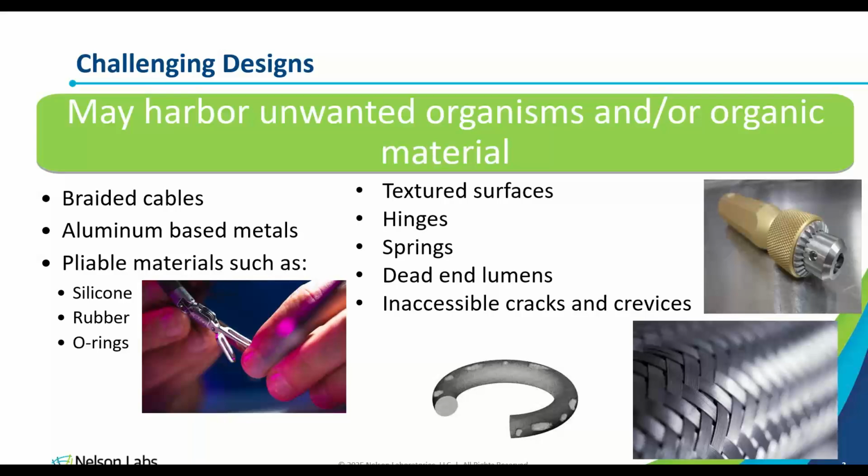Now, I believe ISO 15883-5, which is where you're going to get a lot of information for cleaning validations when you're submitting outside the US, still lists bacterial endotoxin testing as a possible endpoint during your reprocessing validation or your cleaning validation. But if you're looking to market within the US and outside the US, I would most likely not do bacterial endotoxin testing, as it's not a requirement. It's not seen as an applicable endpoint during cleaning validation testing.